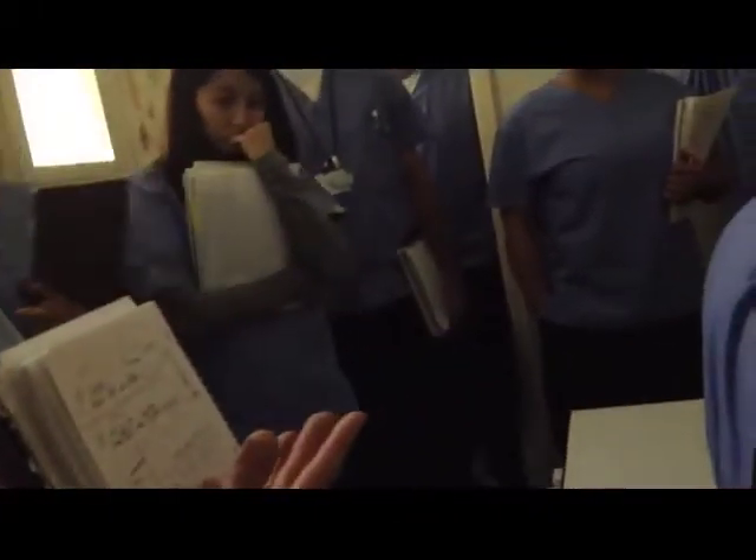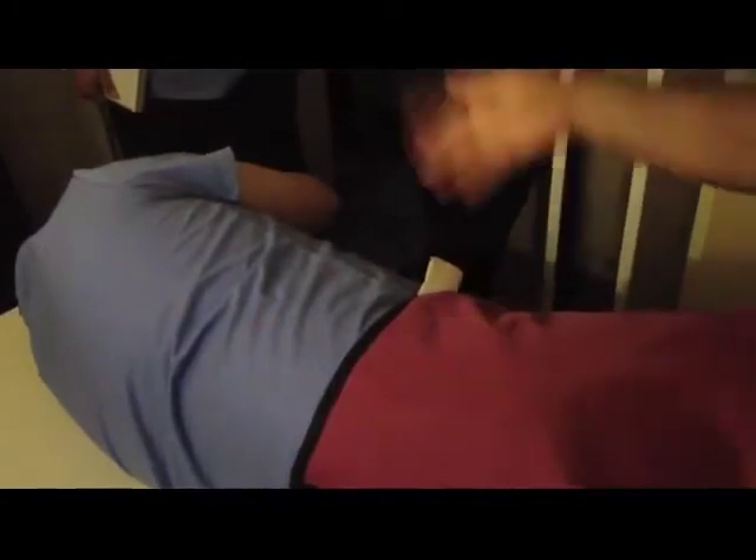The goal is to get it centered. I'm not saying I always get it there. But I'm saying at least let's have at least 90% pretty much centered — 85%. If you can do that, good. Some patients are really, really big and they're difficult; I'm not talking about those. But you should get at least 85%, 88% of your patients nicely centered. As you find that you're getting them nicely centered, then challenge yourself. Start closing it up.